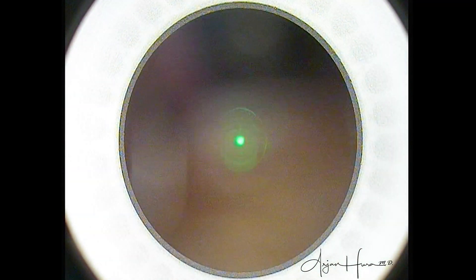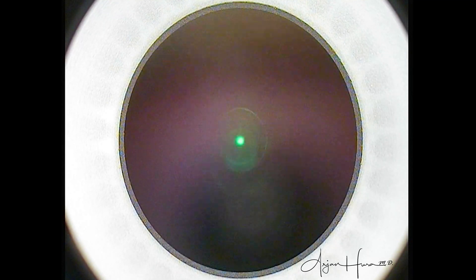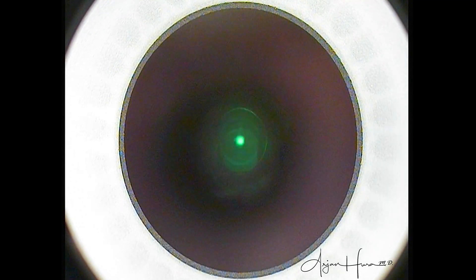Now for our international colleagues who perform SMILE surgery, you might be thinking that's not what it looks like when I use the laser — and you would be right. Here in the United States, the FDA limits the amount of refractive error that can be treated, the number of incisions that can be made, and the interface architecture. The end result is the same, but there are some slight variations depending on where in the world SMILE surgery is being performed.